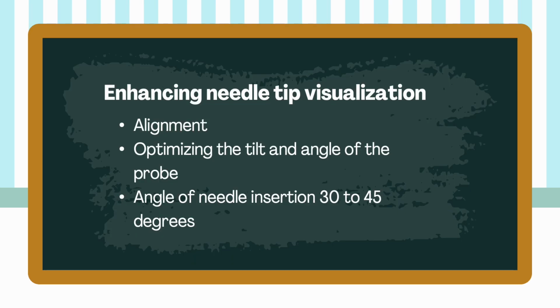While conducting this procedure, the needle tip visualization can sometimes be problematic. Some factors that can improve needle tip visualization in ultrasound guided procedures include using a larger caliber needle, adjusting the tip of the needle so that the bevel faces upwards, or using hyperechoic needles, none of which is helpful for dynamic needle tip positioning for the purpose of vascular cannulations.